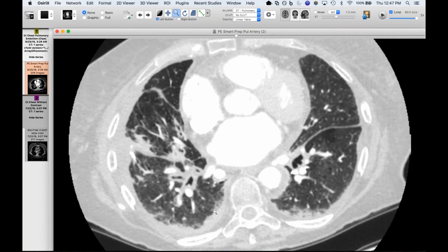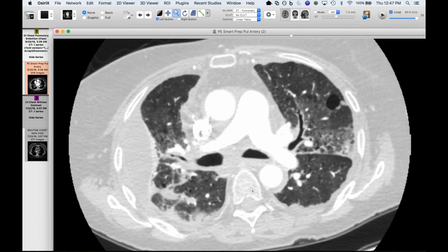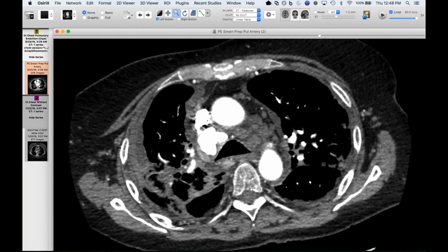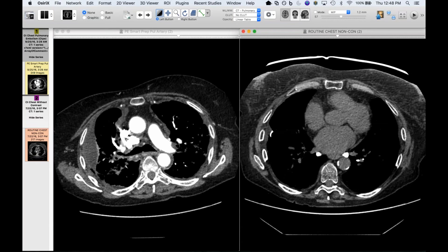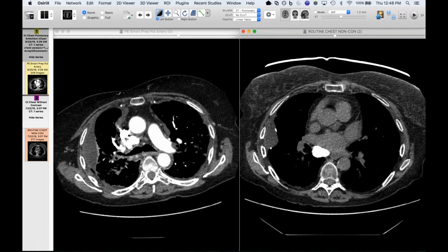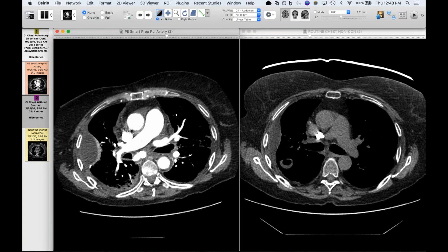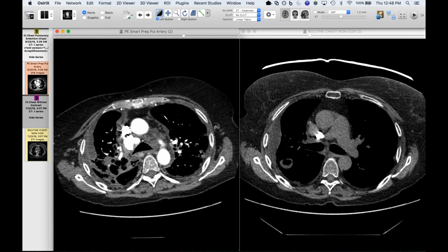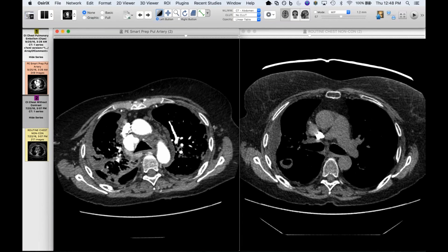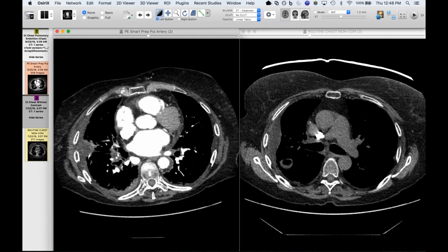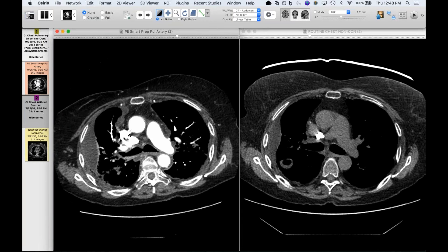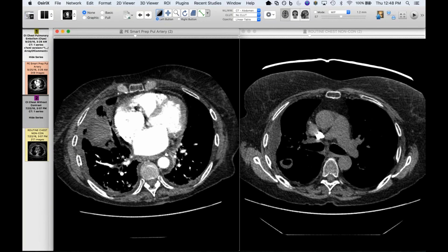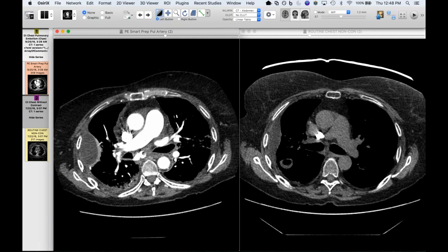Has chylothorax been excluded? No, they don't have anything from this yet. I'm just trying to think why you'd get bilateral chylothoraces, but that would imply a lymphatic process too. Is the size of the pulmonary artery similar across studies, or has the PA gotten a bit larger? It's hard to say. They actually repeated the study this morning because they continued to diurese her, and it's nearly identical — they weren't convinced this wasn't just fluid, but nothing changed. There isn't bulky adenopathy. There are small nodes. There's a very conspicuous amount of fluid in the lower lungs about the bronchovascular bundles. IgG4 was another thing I thought of — some sort of cellular proliferation or deposition. No hint of abdominal malignancy either.